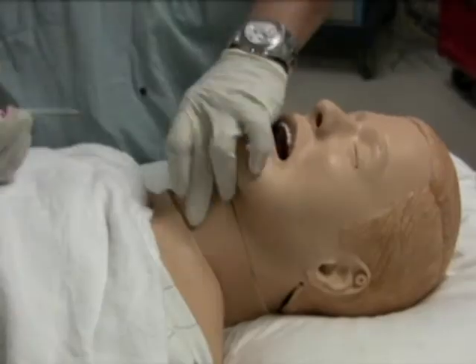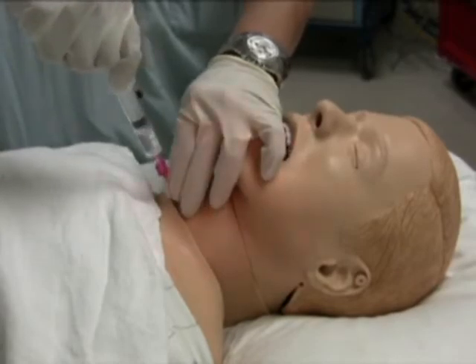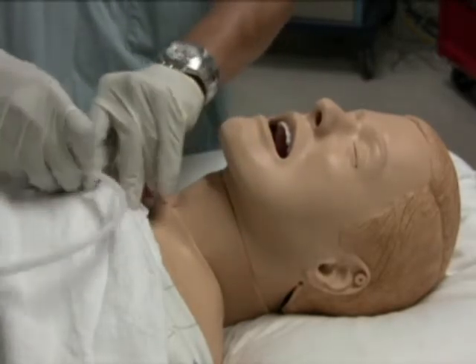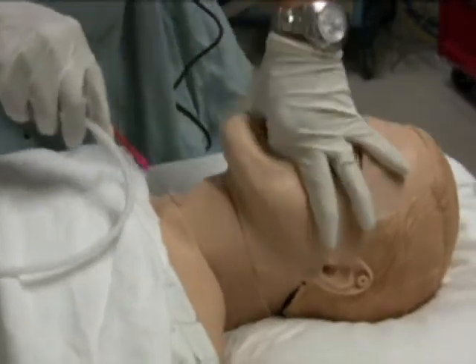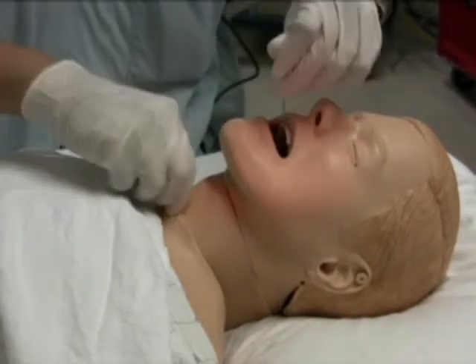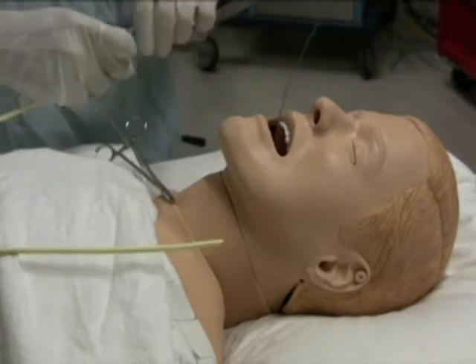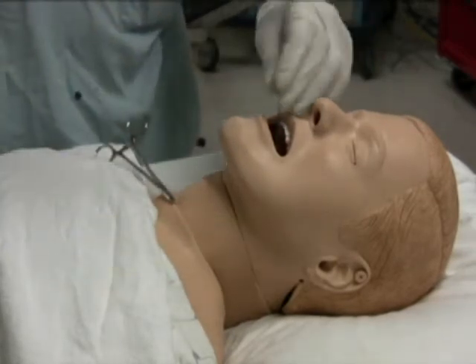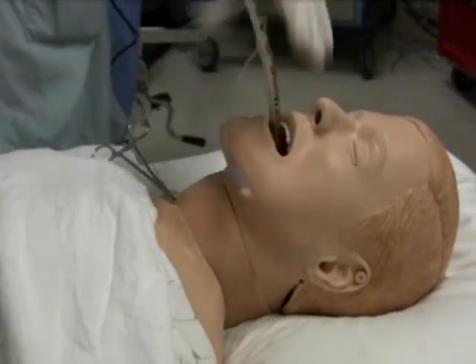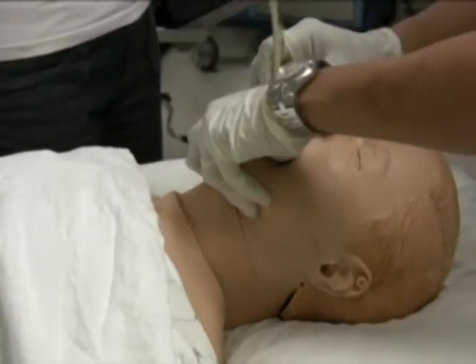The guide wire technique: a vertical puncture of the cricothyroid membrane is performed using a number 18 angiocath attached to a 5-milliliter fluid-filled syringe. After confirmation of tracheal placement, the needle and syringe are removed. A guide wire is then inserted through the angiocath and advanced cephalad into the oropharynx. The wire can be retrieved from the mouth as described before. A hemostat is attached to both ends of the wire to allow easy pulling. A tapered tip guide catheter is advanced over the wire until it reaches the cricothyroid membrane. A tracheal tube is then advanced over the guide wire and guide catheter into the trachea, after which the guide wire and guide catheter are removed together.